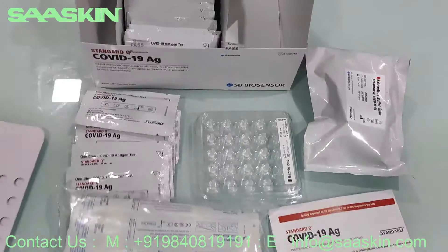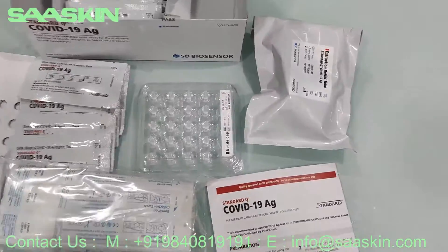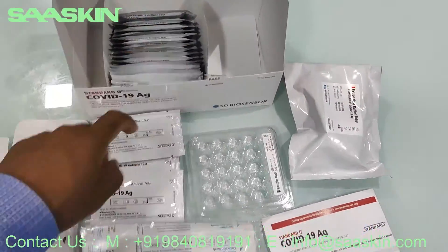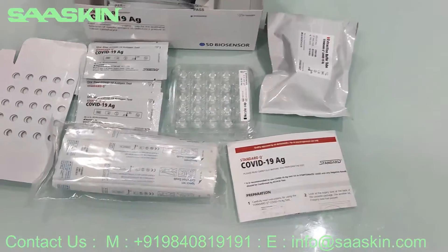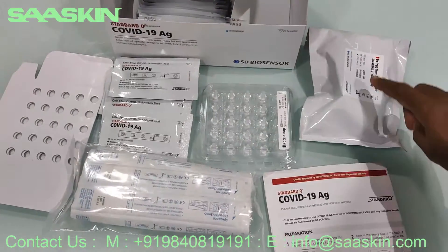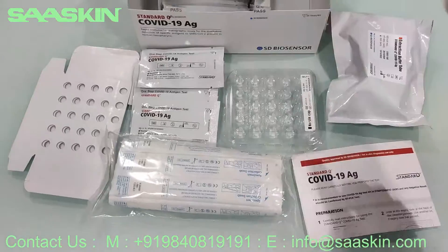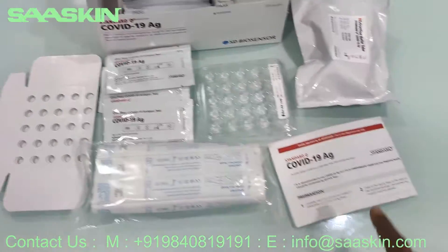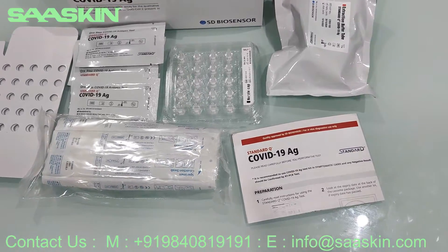Let me give you the contents one by one again. You have 25 test cassettes, 25 buffer tubes, 25 nozzle caps, 25 sterile swabs, one paper stand, and the instruction manual.